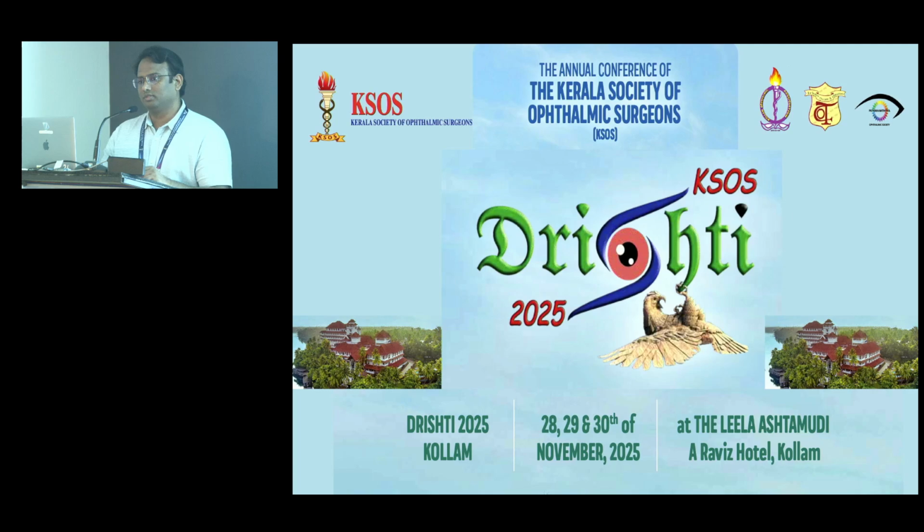One is always available, even with the general ophthalmologist. The IOL Master is available even with the general ophthalmologist. The other is usually available with the cornea departments. So in that context, I believe we can double check with both when you are going to intervene on these high astigmatic cases or keratoconus cases. Then these values are getting double checked by these two machines. Otherwise, there is no scope for changes in those measurements.